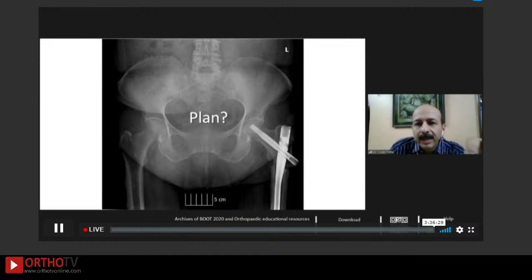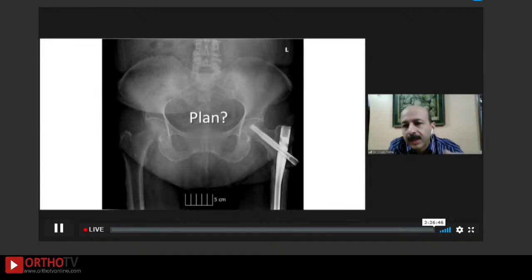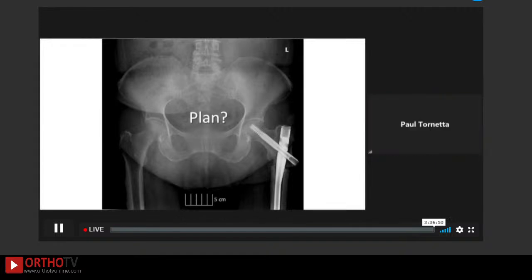And if required, there are papers which suggest that I can use a small plate on the anterior side if I require additional fixation, which may not be there in a 71-year-old lady. With an angle blade plate, I might add a small plate on the anterior femur with a bone graft while doing an osteotomy. That's interesting. It's close to what I would do.